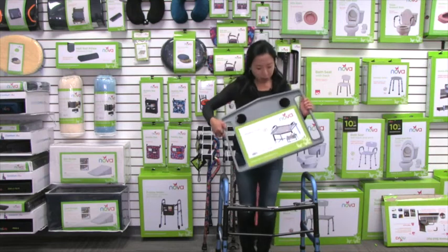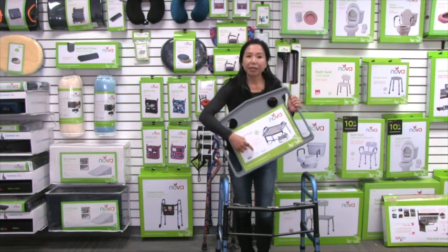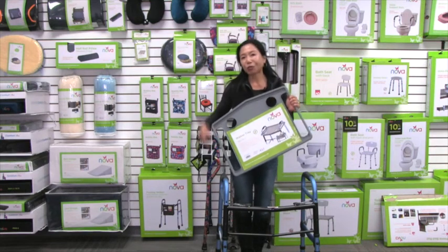As with all NOVA products, it comes with our contact and use information, so you can reach out to us anytime.